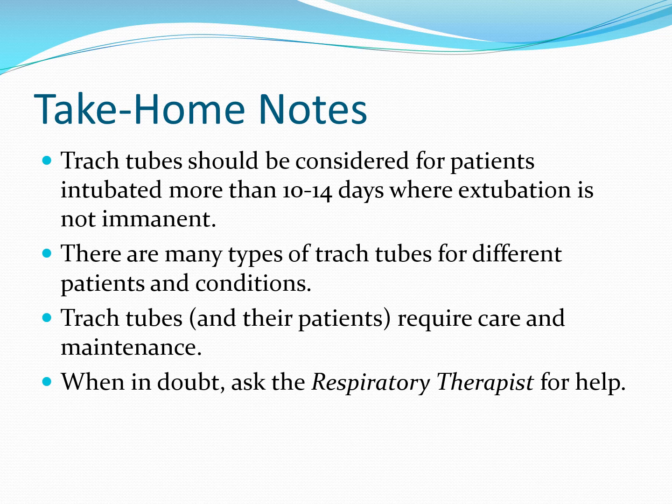So many, and by the way, even more than I've gone over in this presentation, but again, for the sake of covering key points in a relatively limited period of time, we've really focused on some of the most common variations. Trach tubes and the patients that have them require care and maintenance.